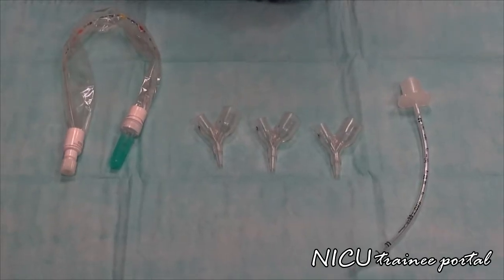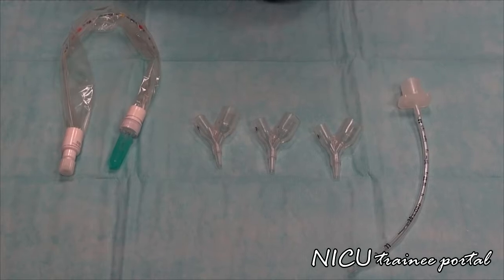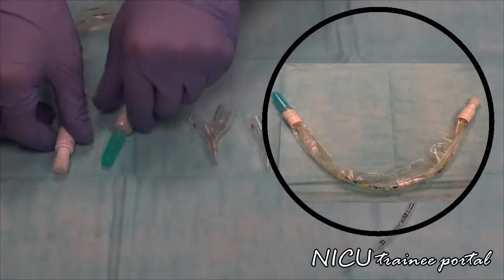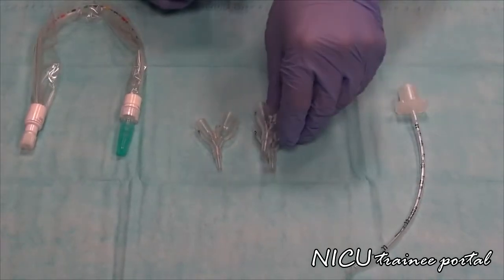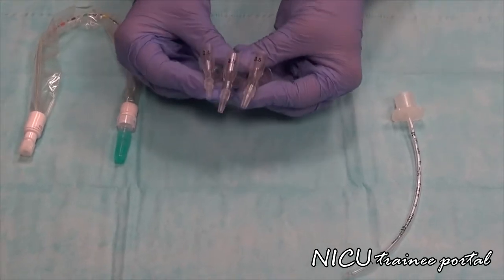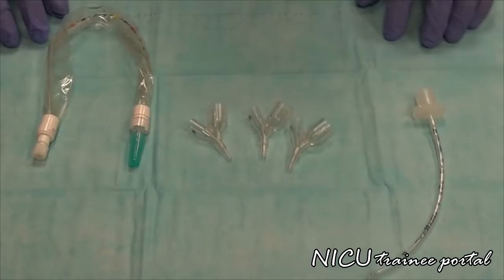In this video, we are going to demonstrate surfactant administration through a catheter. Here at our institution, we use a catheter kit shown here. The catheter kit comes with a 5 French catheter to administer the surfactant through. It also comes with 3 different size adapters for the appropriate size ET tube that you will be using: a 2.5, a 3.0, and a 3.5.